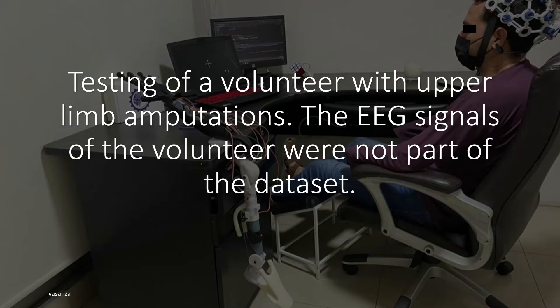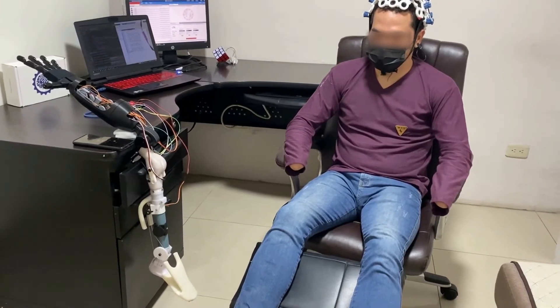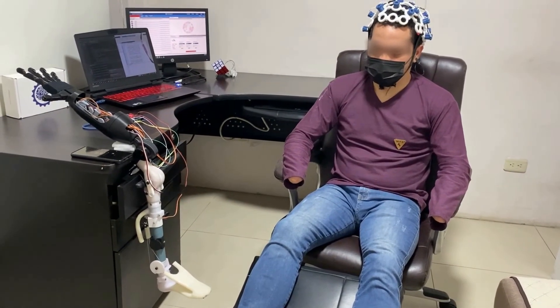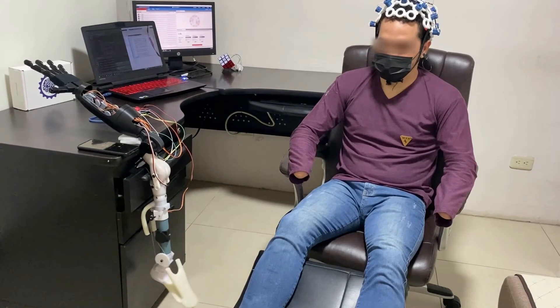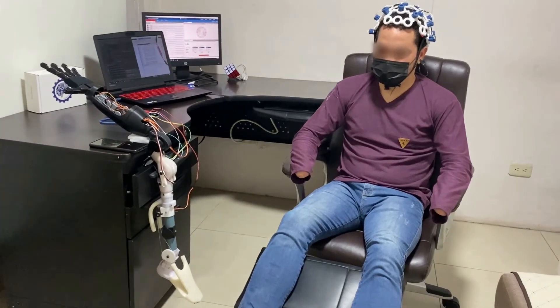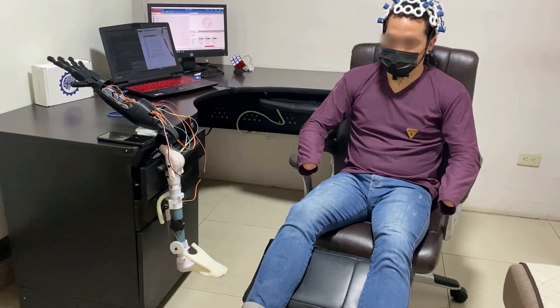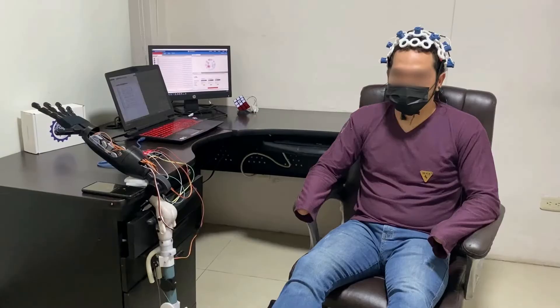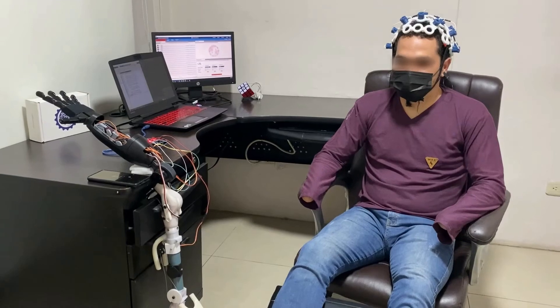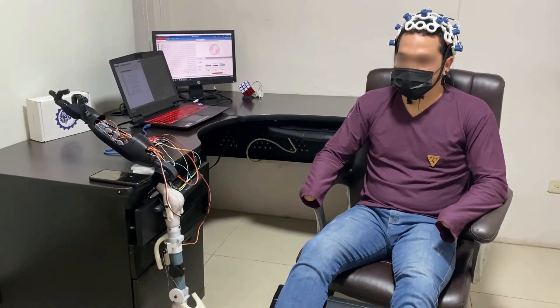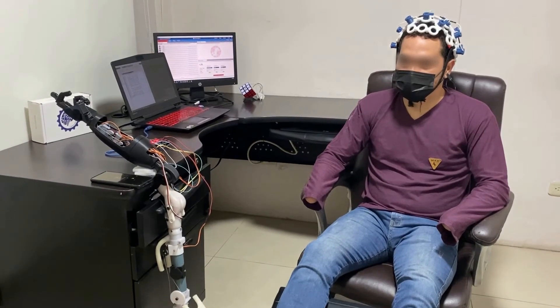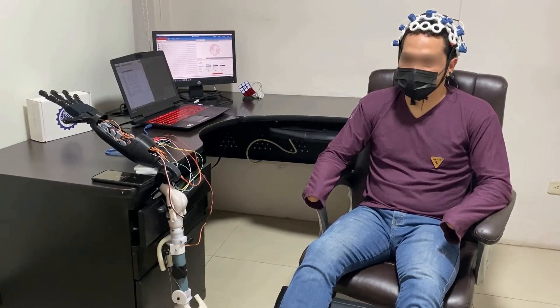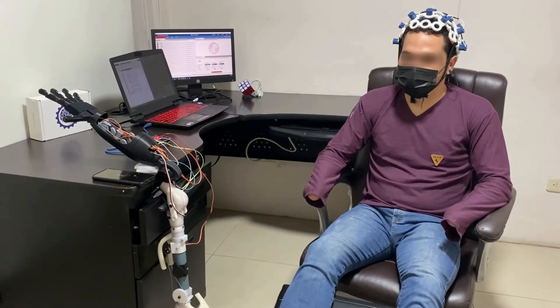Now we will do the test with a volunteer who did not participate in the data recording, meaning the classifier was not trained with this subject's data. The subject imagines moving the foot up, then lowering the foot. The test subject has an upper limb amputation. The subject imagines closing the hand. It is important to note that this subject has experience using active prosthetic control with electromyography signals.